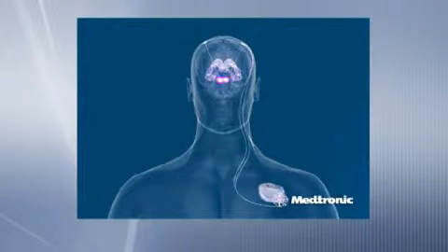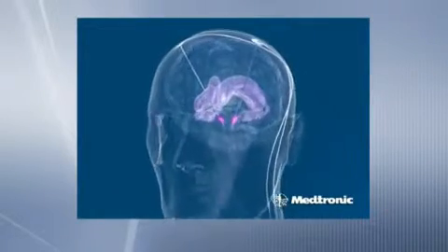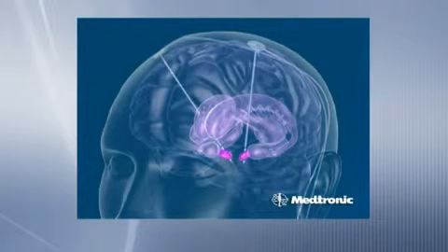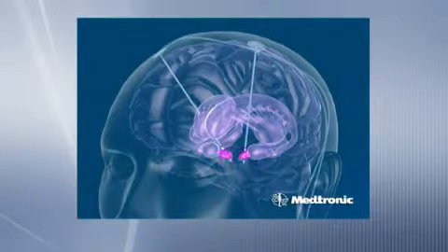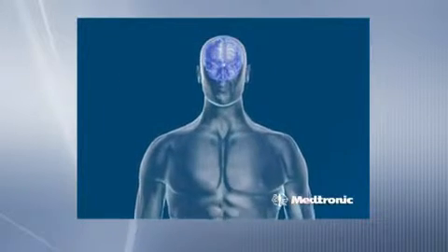The electrodes in the brain are connected up to a battery which is implanted under the skin just below the collarbone in most cases. That battery allows us to deliver a continuous small electrical current to the brain in a very controlled fashion in order to reduce the symptoms and signs of Parkinson's disease or other movement disorders.